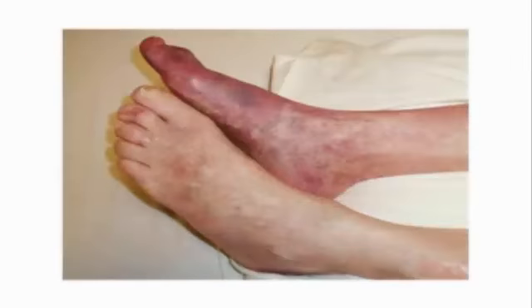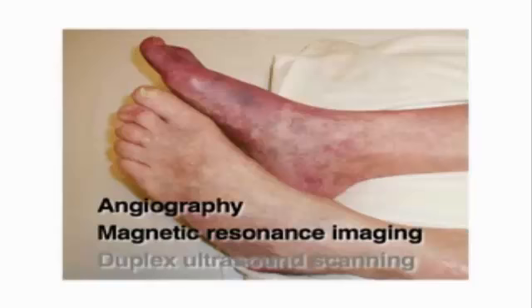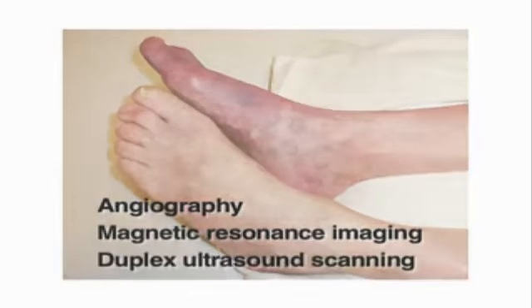Depending on the presentation and symptoms of patients, you may decide to perform additional investigations such as angiography, magnetic resonance imaging, or duplex ultrasound scanning.